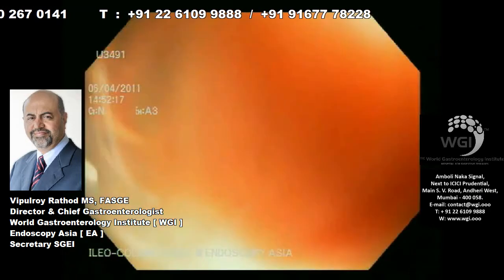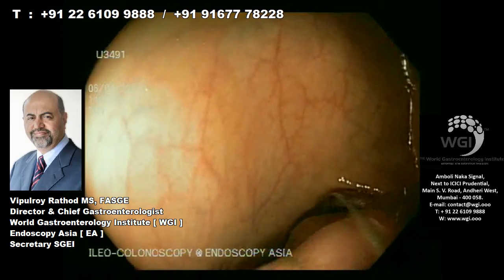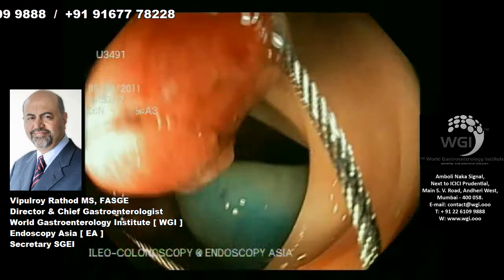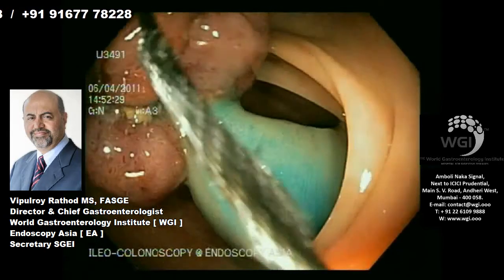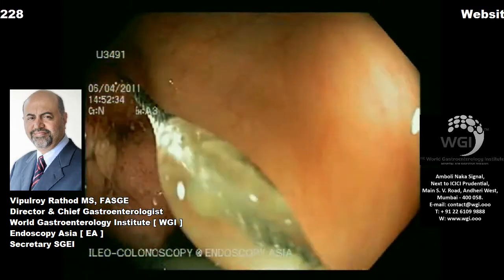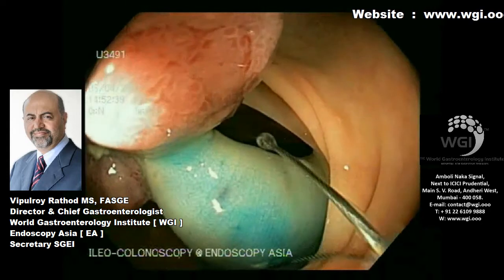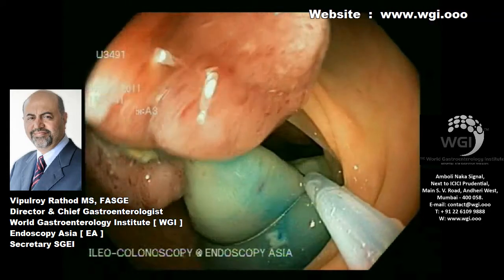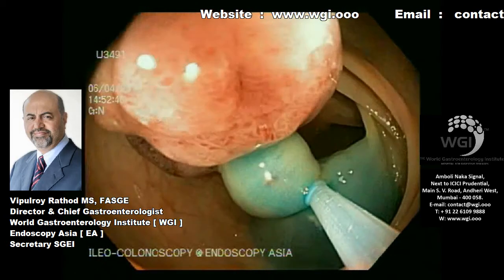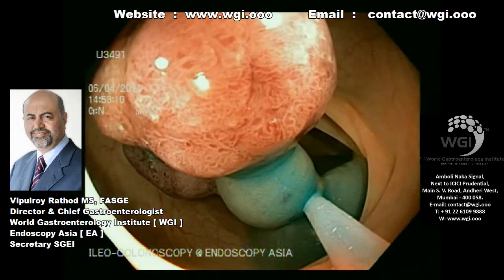We are trying to go around the polyp. The trick is to open the snare and then work your way with the shaft of the scope, rolling the snare over the polyp as you push the polypectomy snare outside the channel. Then very gently ask the assistant to ensnare and tighten the noose. Once you have tightened the noose, inflate that part of the colon and make sure the polyp is not touching any wall of the colon.